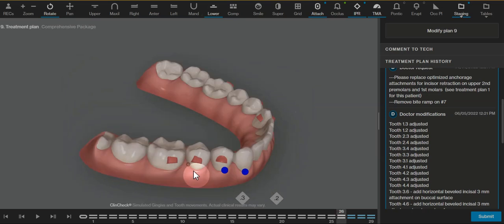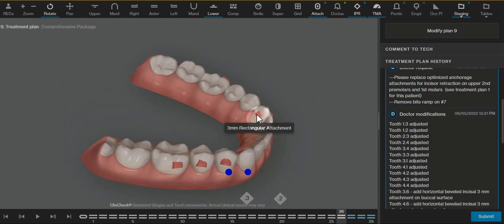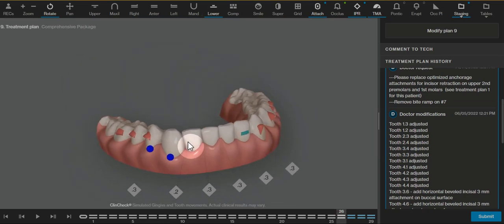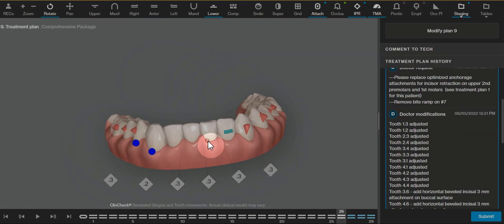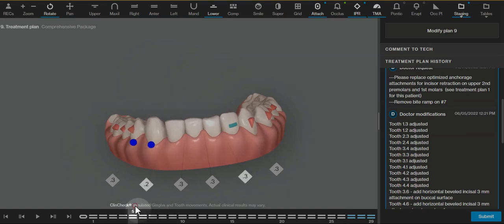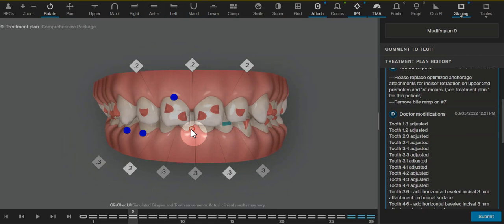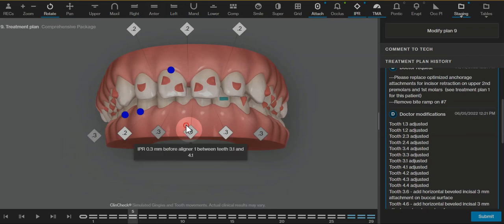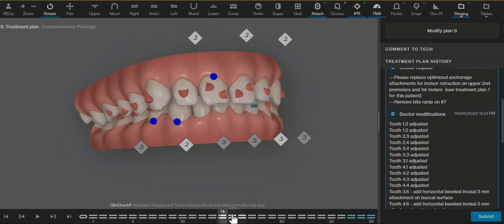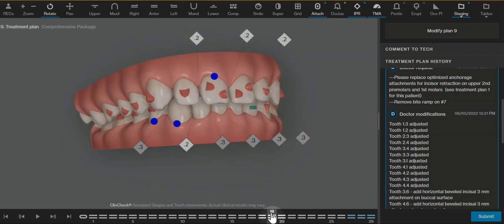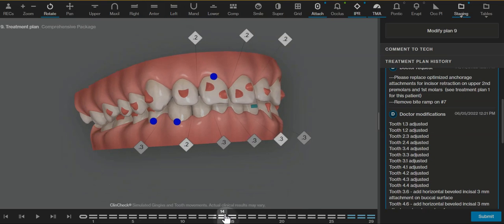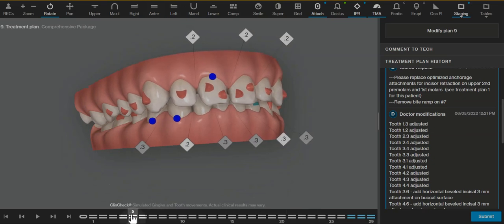Then we have Dr. Galler's secret sauce, which is the lingual canine attachment to help with that intrusion. I added a minimum amount of IPR to finish with the proper amount of overjet that I would feel comfortable with that wouldn't lead to an anterior interference. If you wanted to add more IPR, I think that's not a bad plan.